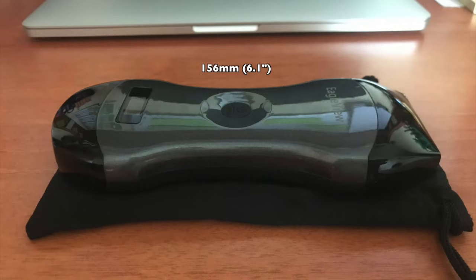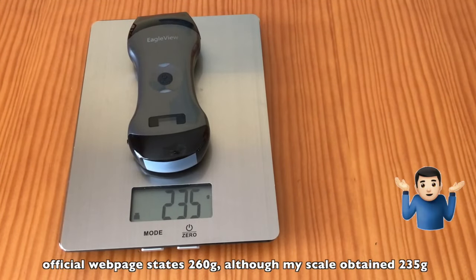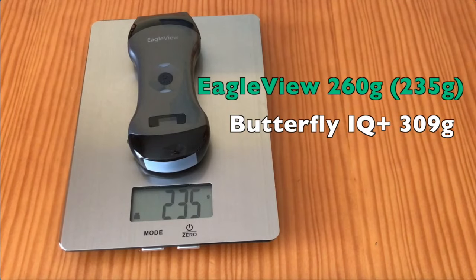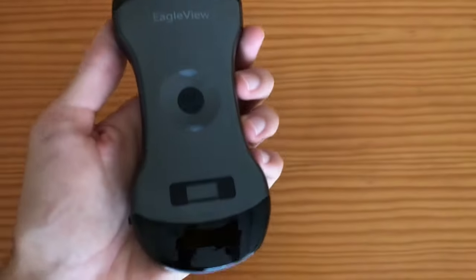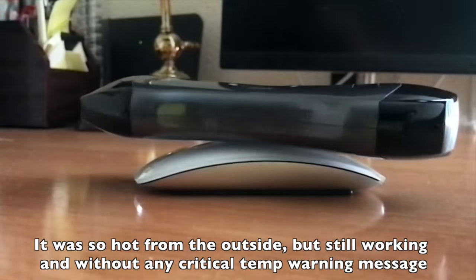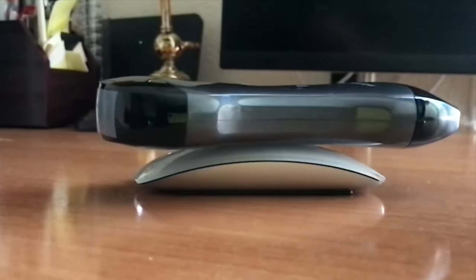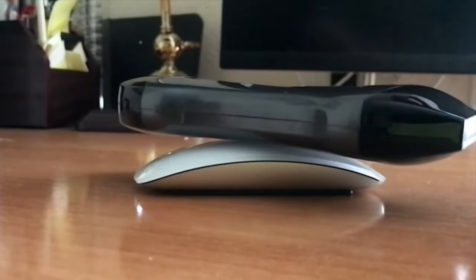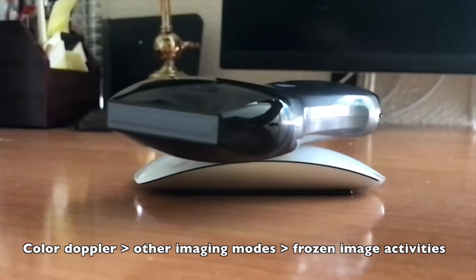It measures 156 × 60 × 20 mm (6.1 × 2.4 × 0.8 inches) and has a glossy finish, weighing 260 grams (0.6 lbs), which lies between the Butterfly at 309 grams and the Viscan Air at 205 grams. It has an integrated battery of 4,200 mAh. In my case it allowed approximately 30 minutes of continued use before it overheated, and almost 3.5 hours of total scan time before recharging. Color Doppler drains the battery more quickly than the remaining imaging modes.